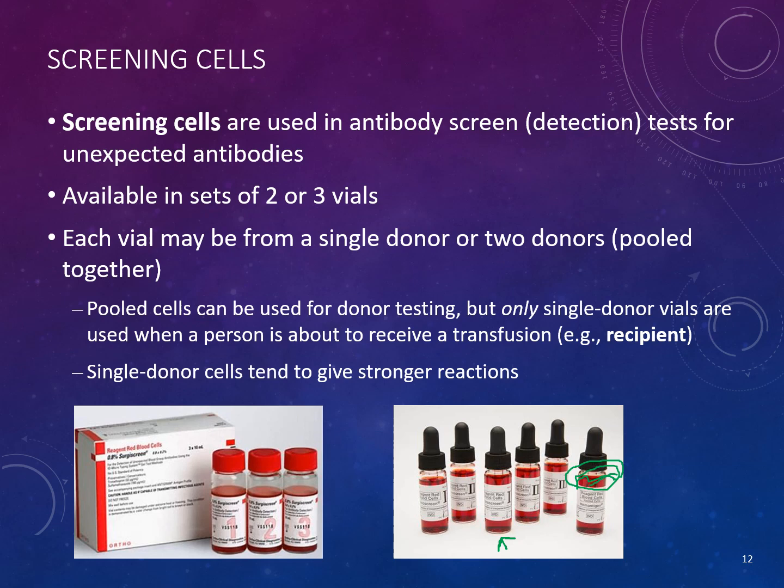So if I were working in blood bank and I saw this, I would not use these reagents for testing, because obviously there's some hemolysis going on and it could potentially interfere with our reactions.